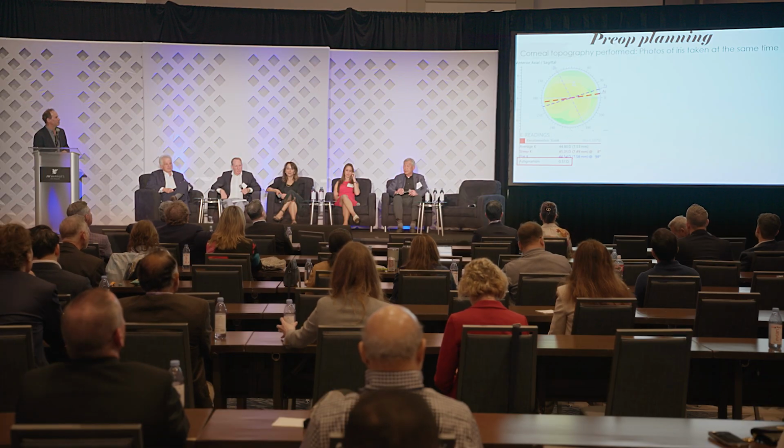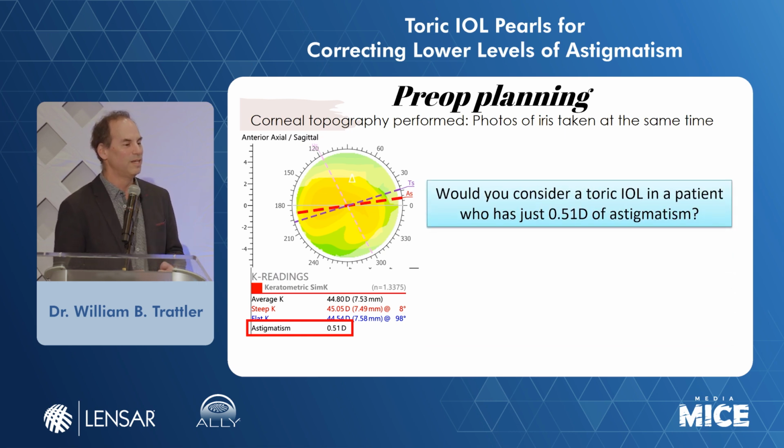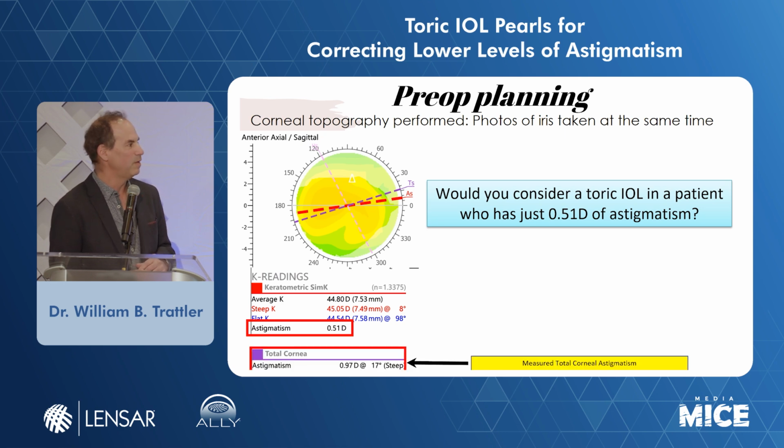We have a patient that has 0.51 diopters of astigmatism. It's at this axis. Axis is about 8 or 10. Obviously, the axis is critical because it's not just 0.5. We should be measuring the total astigmatism. And so while the keratometry says 0.5, if you look at total astigmatism, we have a couple of devices.